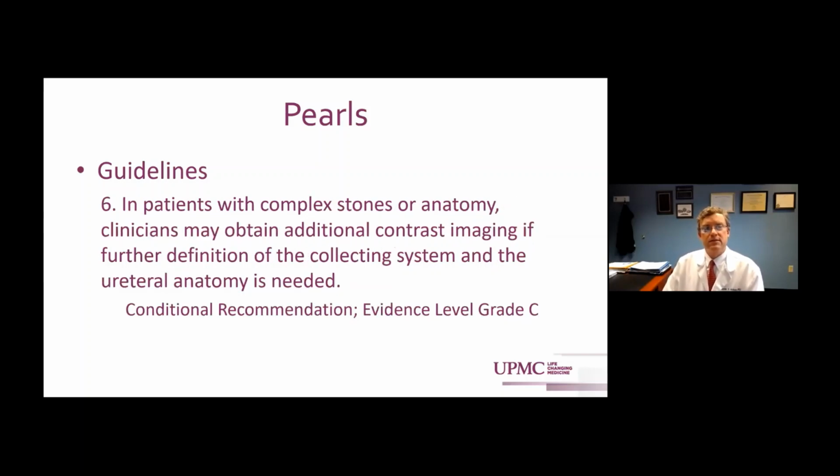Guideline number 6. In patients with complex stones or anatomy, clinicians may obtain additional contrast imaging if further definition of the collecting system and the ureteral anatomy is needed. And this would really, again, be the delayed imaging. What does the collecting system look like? Some of the determination, what calyx am I going to address? And I know that was just presented in the last talk, a nice talk about surgical management of kidney stones. That's where you'd want to get some better imaging of the actual collecting system.